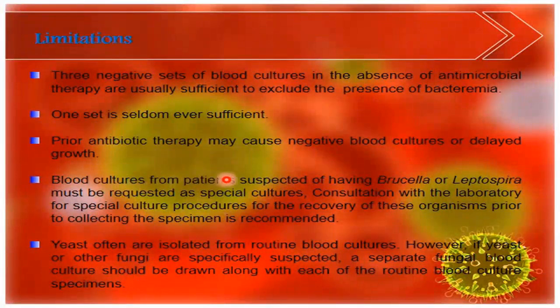Blood culture from patients suspected of having Brucella or Leptospira must be requested as a special culture. Of course, why? Because brucellosis and Leptospira infection need specific or special culture conditions like carbon dioxide, enrichment media, selective media, and so on.